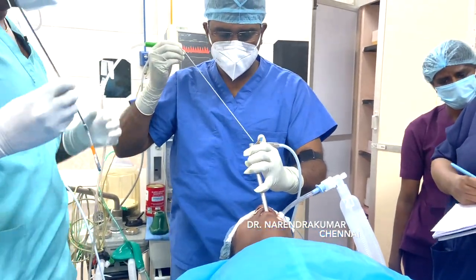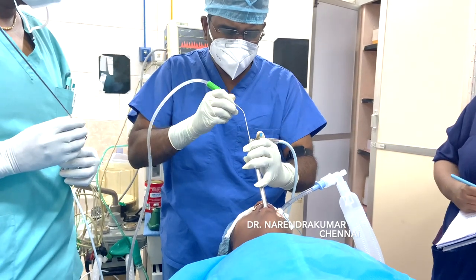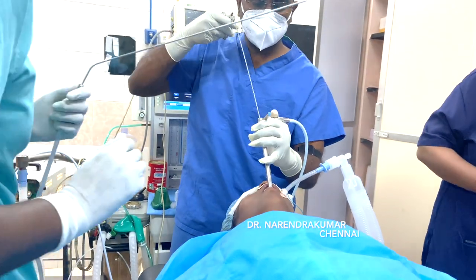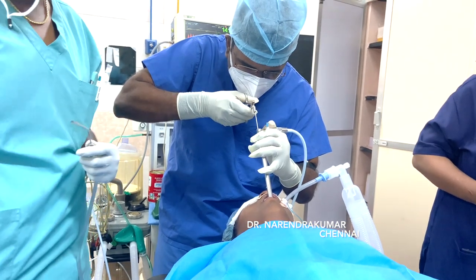Apply some suction and make sure the foreign body is clearly visualized. Then, using the cup forceps, gently capture and catch the coin.